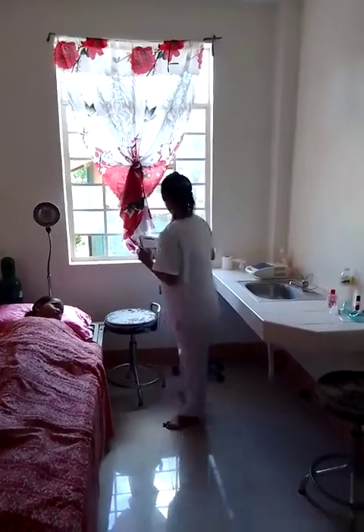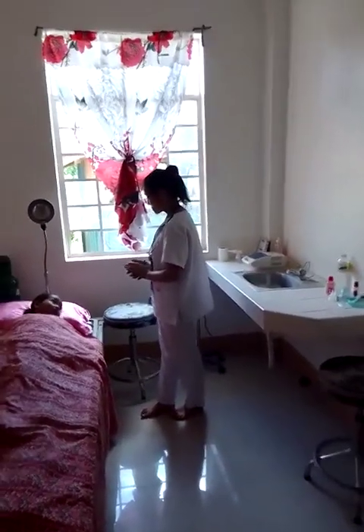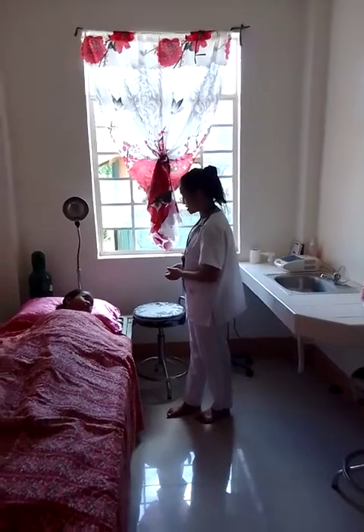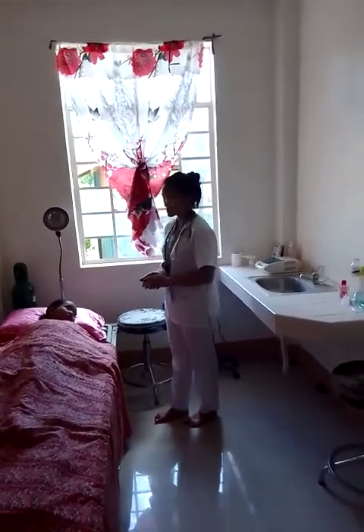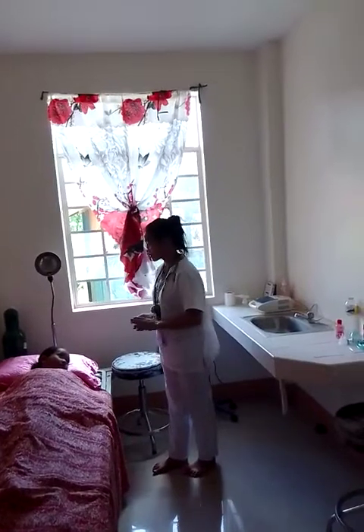How old are you? 6. Okay. So we will do nebulization for you today. Nebulization, ma'am, is a procedure of administration of medicines to the respiratory system.